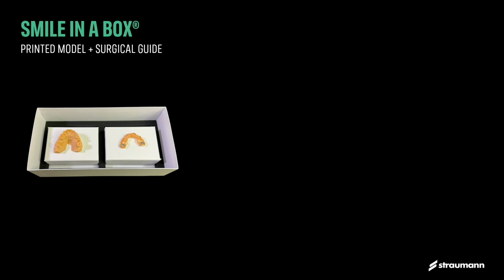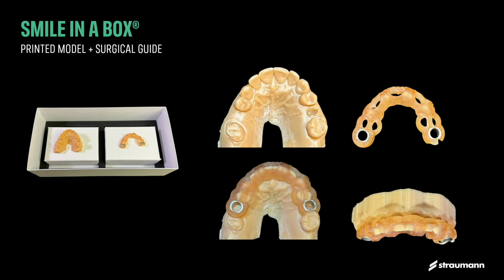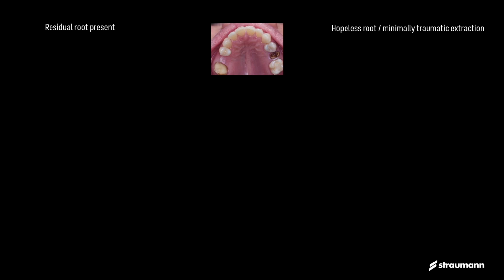Now let's get practical. We also opened the box. I ordered the model and I ordered the guide. The reason I ordered the model is exactly to see if, with regard to guided surgery, it fits the model, if there will be any interference during the surgery that I need to be aware of, that I need to work on so the guide fits precisely. So I checked, and here is how the surgery took place.